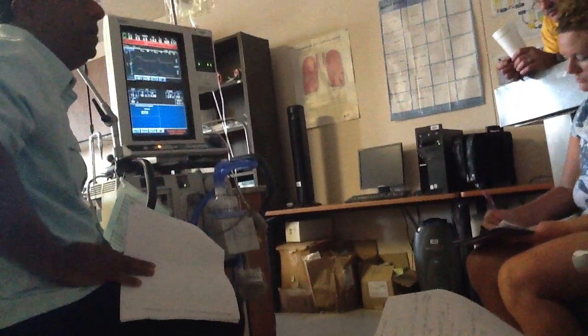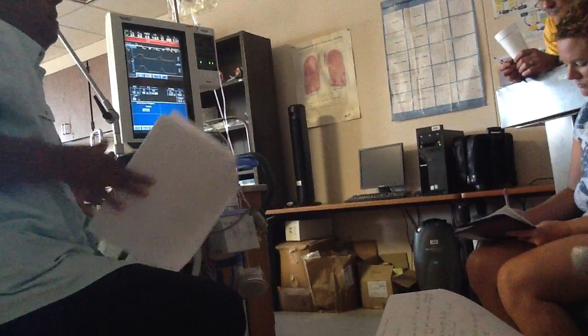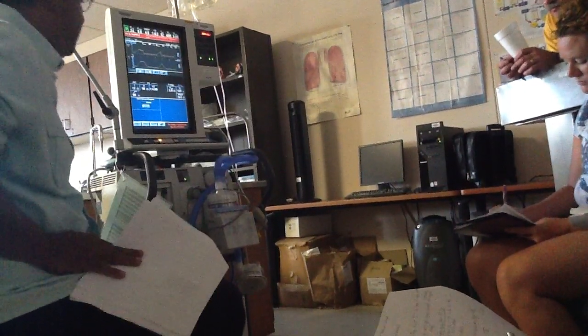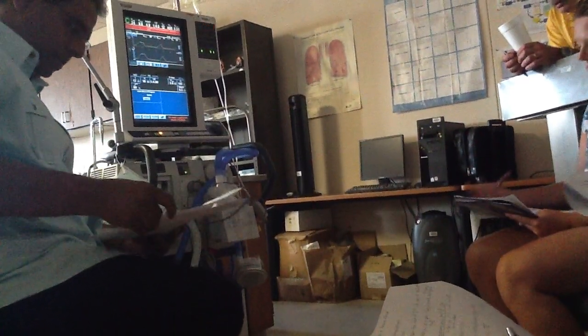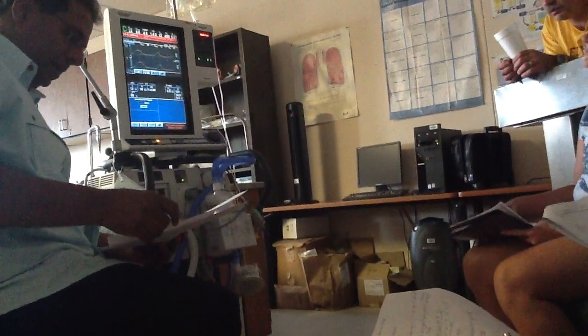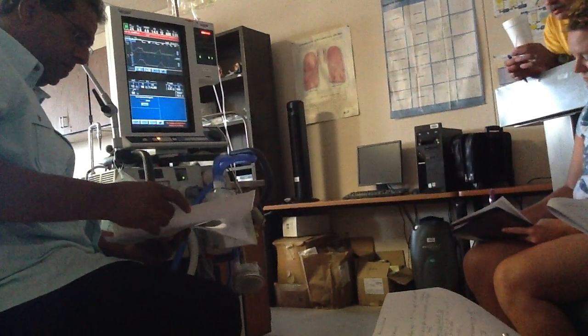But if he's getting better, that's going to go up on its own, correct? If he's getting better, the exhale tidal volume will go up with that much pressure because you're more compliant in your lungs. Alright? Okay, what happened to you? You did an ABG and again your PCO2 is high and PO2 is low.